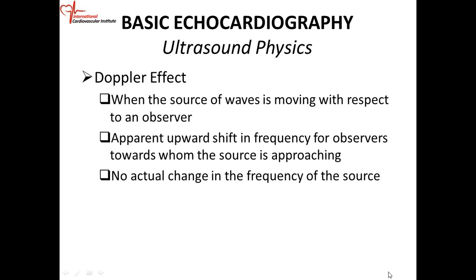So a basic understanding of Doppler is, we commonly use the scenario of being at a train station, standing at the train station.